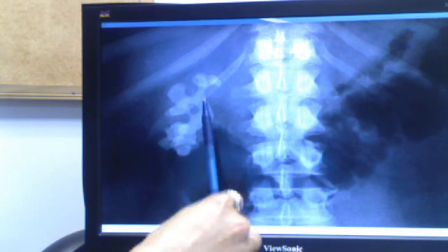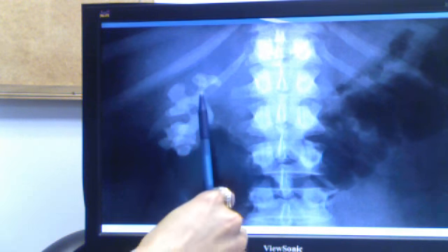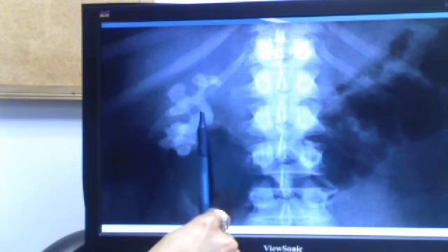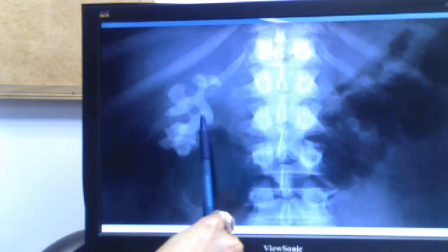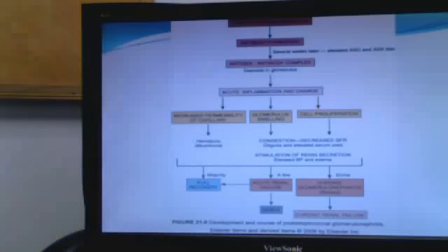It's the outline of the pelvis and the calyces, and the reason we see that is because this is a stone. So a stone has deposited, or a stone has grown in the calyces and the pelvis, and because this stone is most likely made up of calcium, once we take an x-ray of this patient, it will show on x-ray. Okay, the calculus or the lith, this is a pelvolithiasis, shows on x-ray because the stone is made up of calcium. Big stone. Okay, so let's go back to UTI.